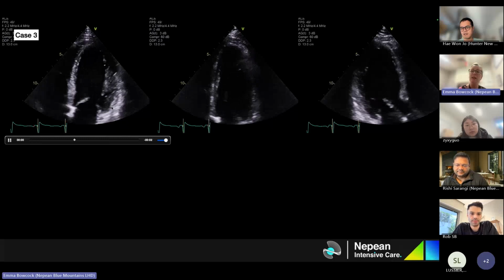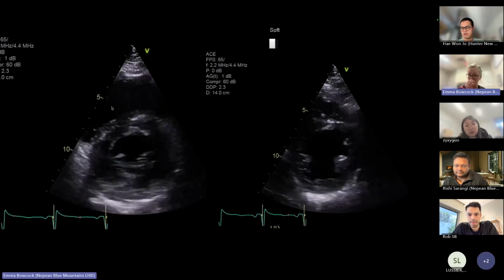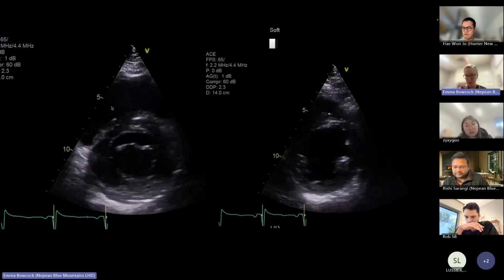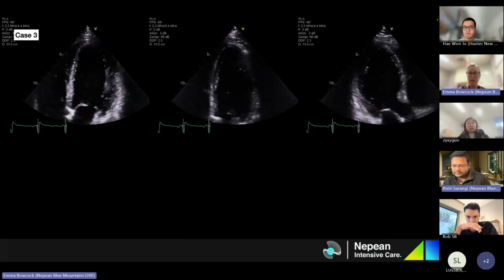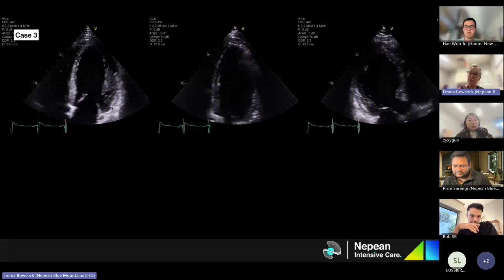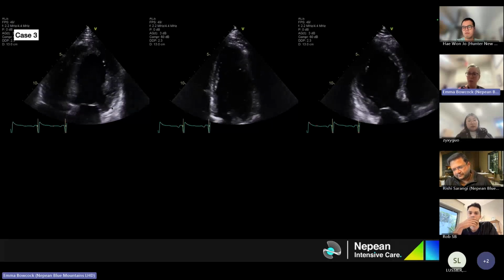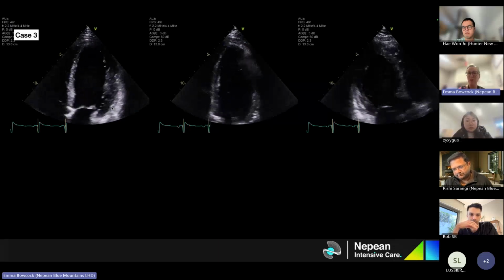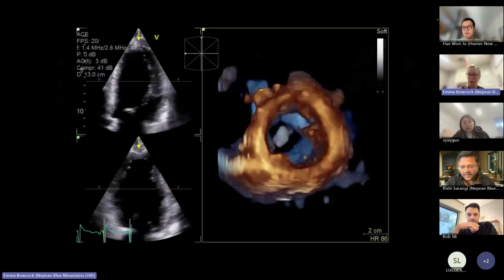I'm not sure it does, Rishi. And also you've had the short axis views to look at that as well. It doesn't look like one of those sort of edematous myocarditis pictures, but that's fine. That's a very small point. Sometimes the walls can look thin in a 4-chamber, especially if you're not quite seeing the endocardial border definition properly. So always really key, you need orthogonal views. You can't comment on LV function without seeing it in the short axis as well. You can get a feel, but you can make big mistakes if you just view in one plane and not orthogonal planes.